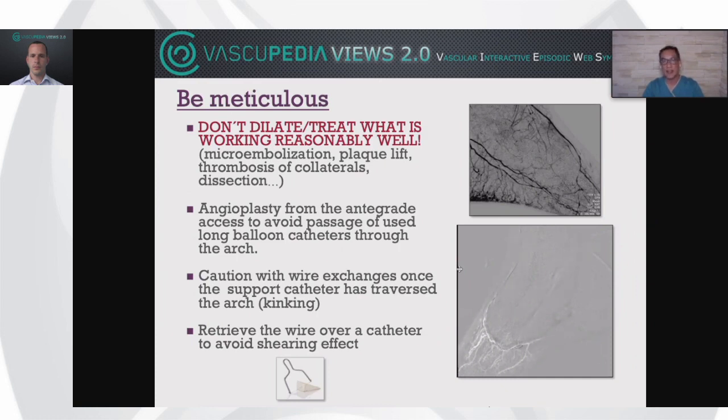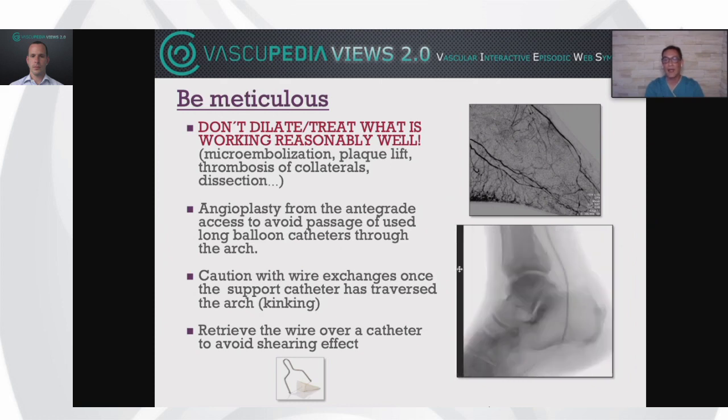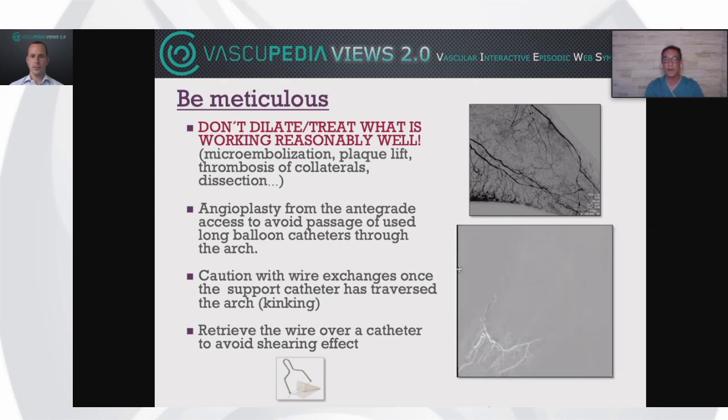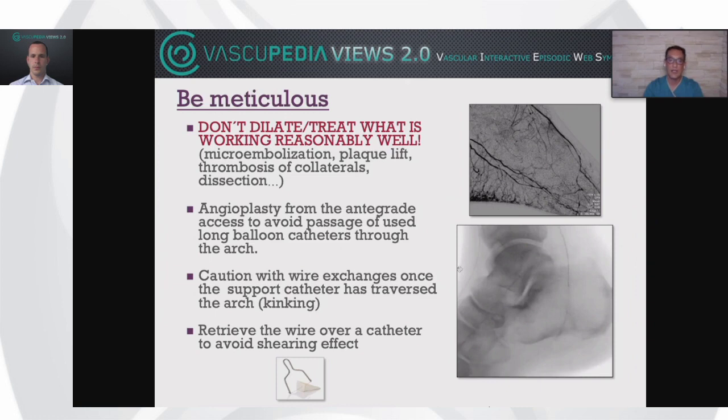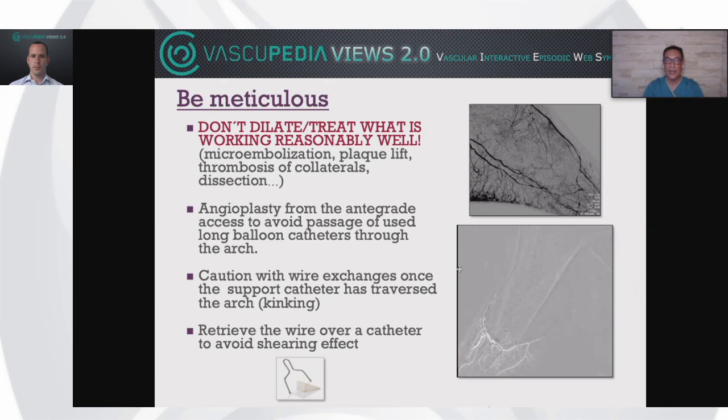And as Roberto Ferraresi always mentions, don't dilate or treat what is working reasonably well. You can feel tempted to use the arch as a pathway to treat an opposite vessel. But when you feel tempted to do that, always think that you can end up having a thrombosis of the arch, dissection, or microembolization. And if you use the arch as a pathway, try to perform your angioplasty from the antegrade wire in order to avoid passage of used long balloons through the arch, to avoid a spasm or any injury.